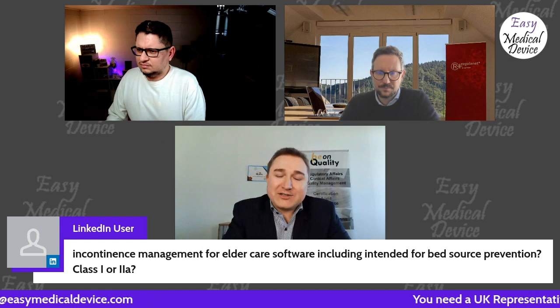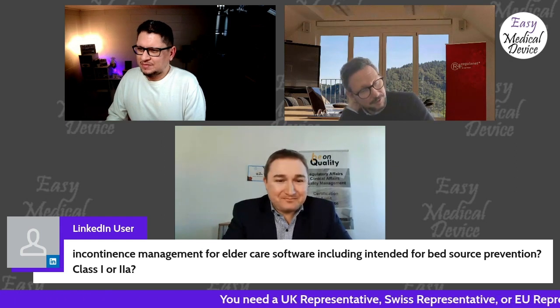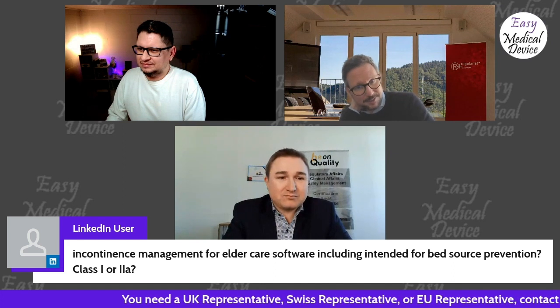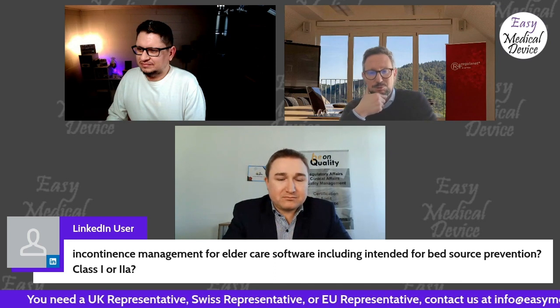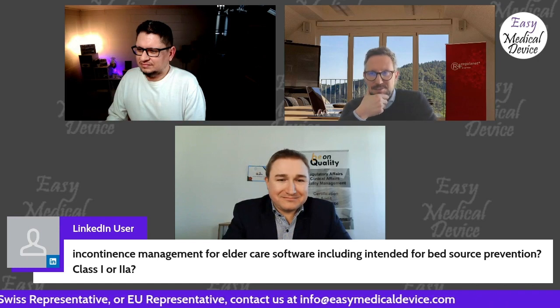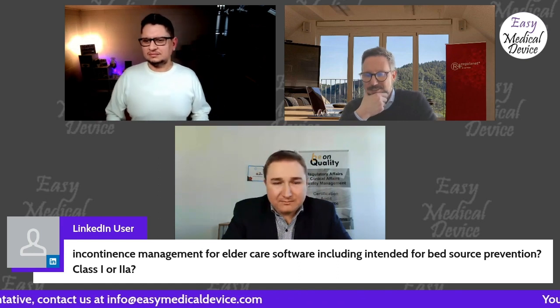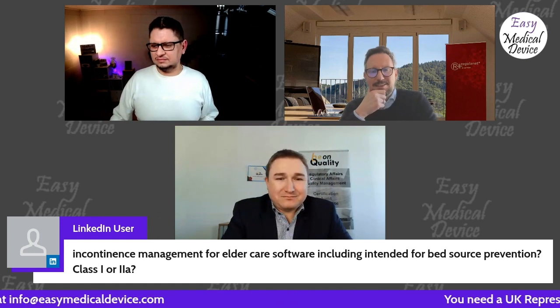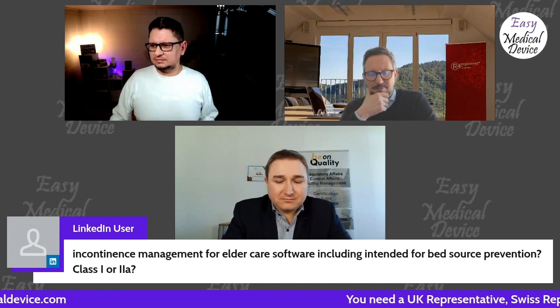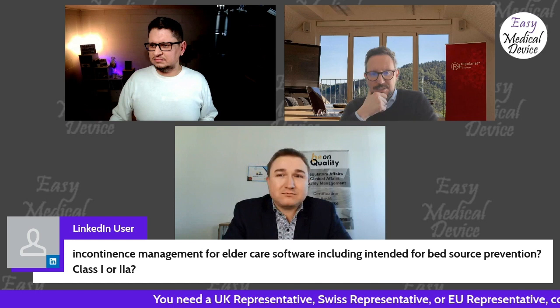But it's a funny question. It's a very good question. Okay, yeah, I agree. So it can be none, depending on what this incontinence management does. That's too generic here. But if you think about the typical incontinence management functionalities, even things like pelvic floor exercising or something like that, I would still see that as class 1.